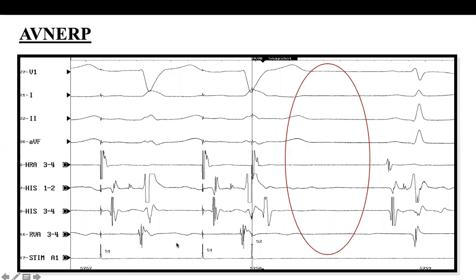It is a program, we call it programmed stimulation. Sometimes we don't care about the activity of the heart itself, so as to be able to study the effective refractory period of a structure. When we do this, we do it in a programmed way.